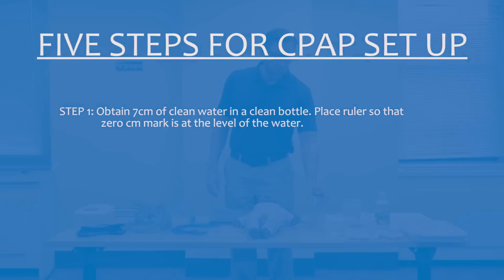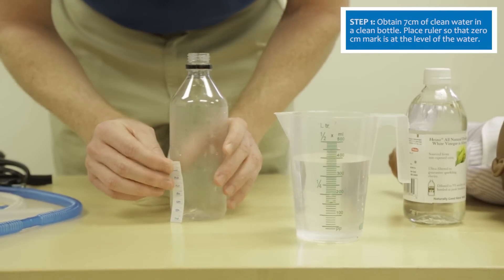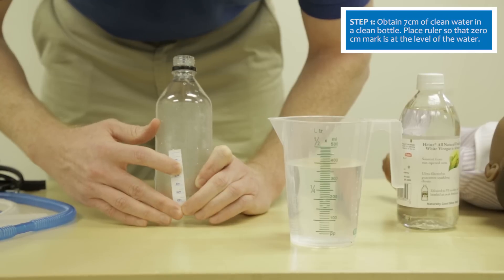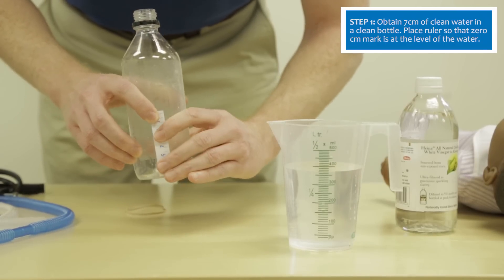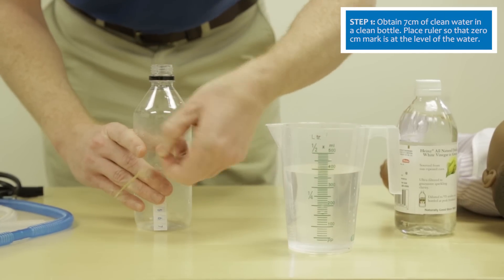First, obtain a clean bottle and apply the tape measure to the side of the bottle. The important thing is the zero is at the top and the seven is at the bottom. To secure the tape measure, place a rubber band around the tape measure and bottle.